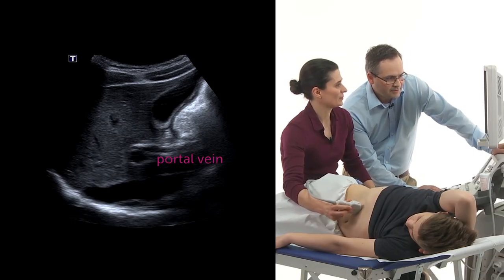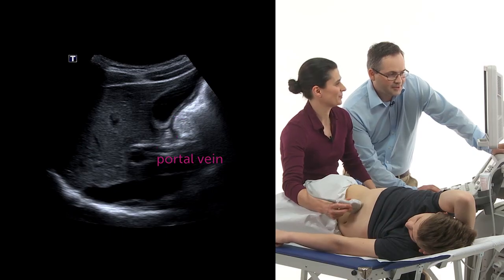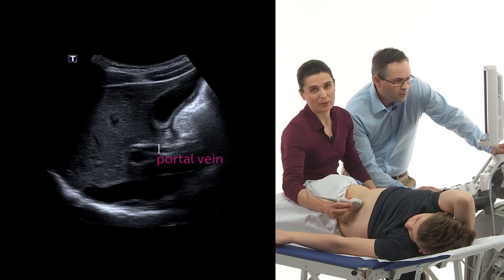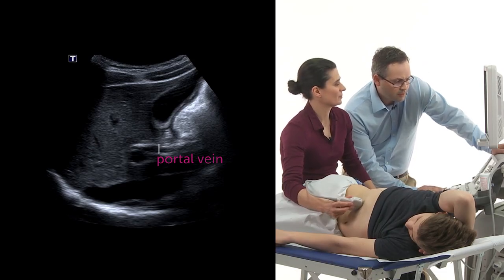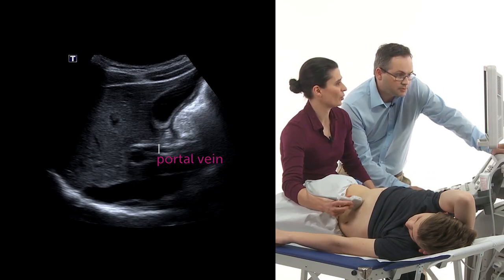Portal vein over here. And what's this small tubular structure? This should be the common bile duct. Correct, the common bile duct. It should not exceed 6 millimeters in diameter. I can measure it, when the gallbladder is present. Only 3.9 millimeters. So this is normal.